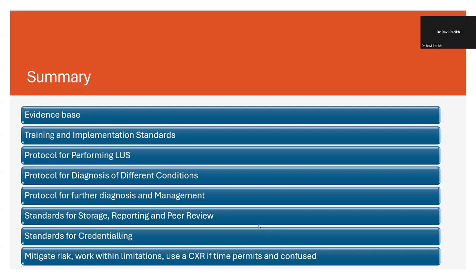But if I find an anterior air leak, and I would argue that you need to do both right and left anterolateral regions, I might decide to treat that first. It's all about going case by case. More or less, I think you'd end up having to do comprehensive scans, but scanning each individual intercostal space transversely in an extremely preterm 23 or 24 weeker is a huge amount of handling. I'd just be cautious about that.